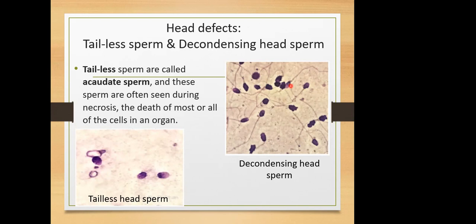You know how a nuclear staining looks like. And so you realize that, yes, in these ones we have decondensing. But even for this one, it cannot be entirely decondensing because the end here doesn't look like a nuclear stain. And similarly, this one too. But the majority of them here are decondensing.